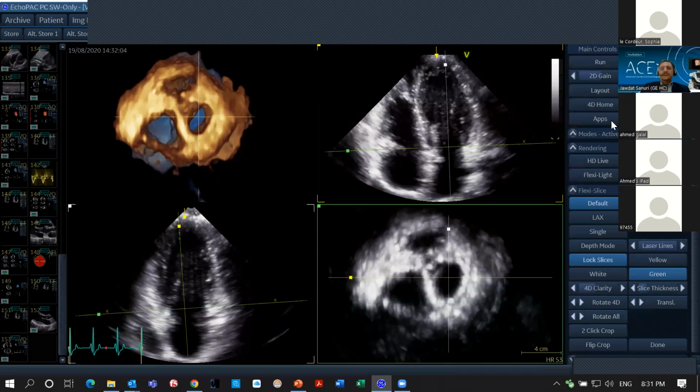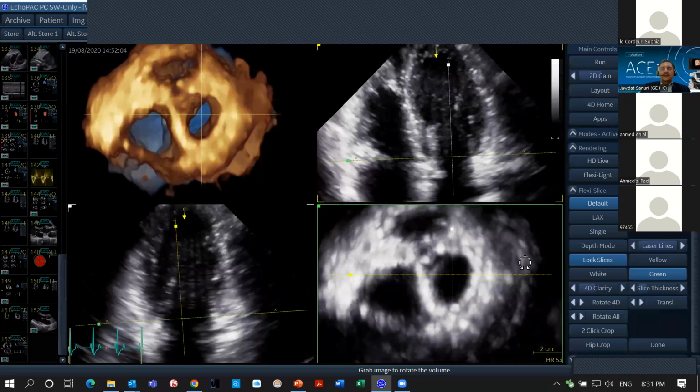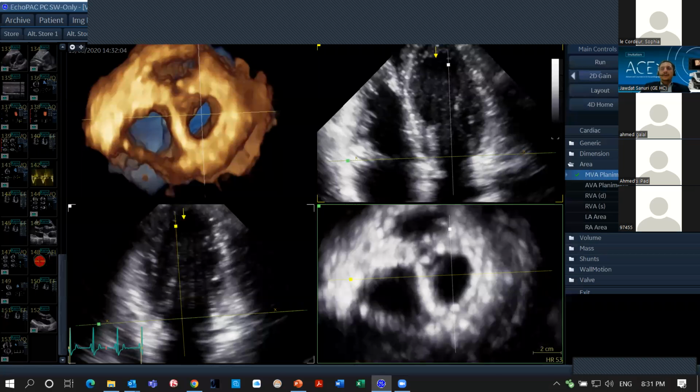Yes, so you are basically using this measurement to measure the annulus area, the mitral valve annulus area. Yes. And you're saying when you do 4D, it is not as accurate as here. Yes, true. So I don't know what my defect is there in the MVQ method. The tracing is okay. I mean, the setting of points is easy. It is 5-6 points, you will set it. But the annulus area will not be accurately assessed.